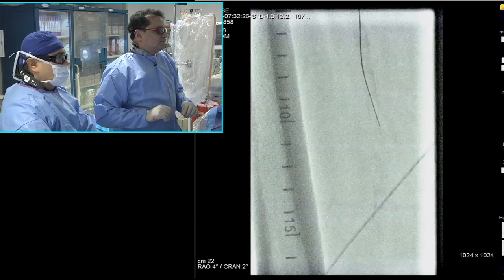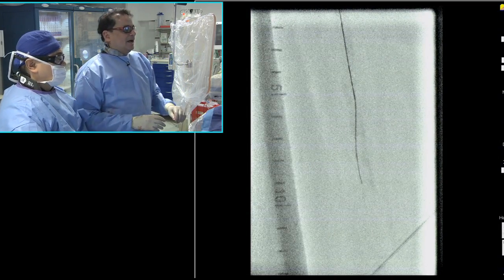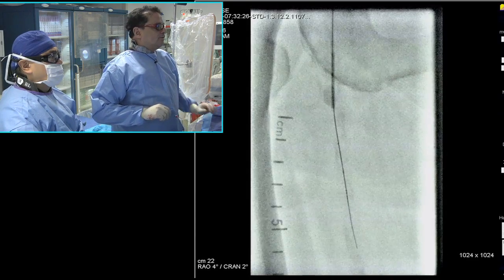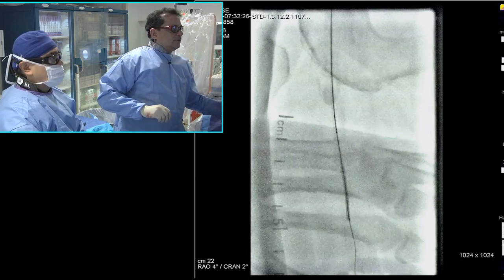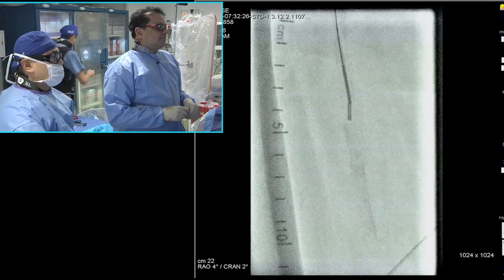You can see it's within that calcific shadow, but there it seems a little subintimal. Now remember, I have not advanced the catheter. Even if I created a small dissection plane, it's an 014 dissection plane. It's not an 035 dissection plane. So I'm okay with all that. So, let's see. I mean, let's play with this for a few minutes before we convert.